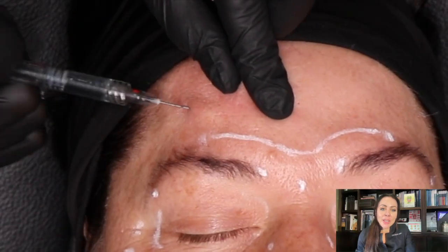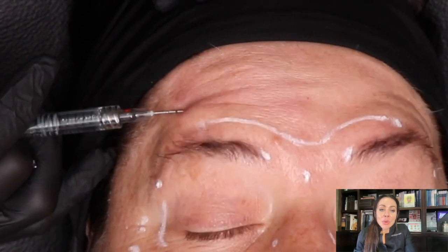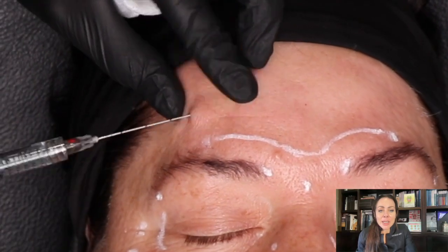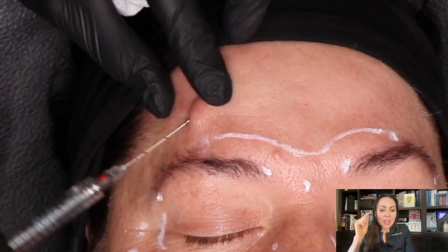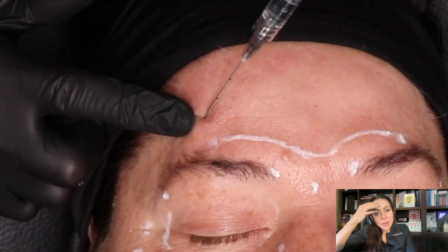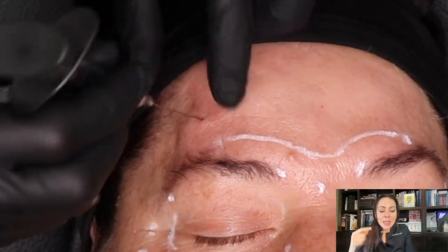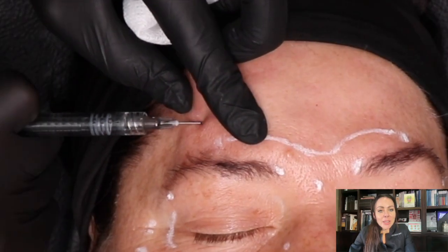It's quite important that you don't push the cannula all the way to the midline and then do retrograde tracing, because that will result in spaghetti strings. What I'm demonstrating instead is small little boluses — I often call it a 'risotto' instead of 'spaghetti.' We go towards the midline with small micro boluses, then move to the next vector. The majority of the product should be in the middle part of the forehead, where we lose the most volume. If there are wrinkles at the top, we also address those.